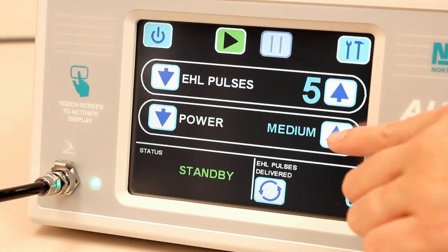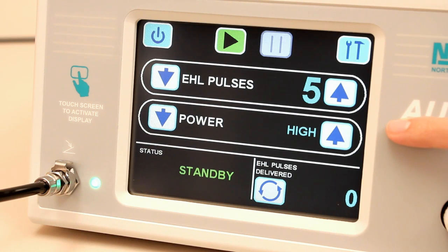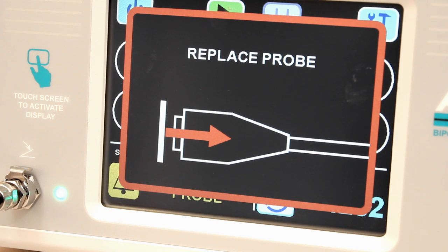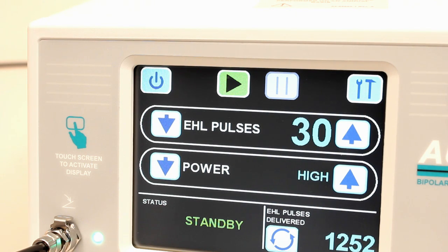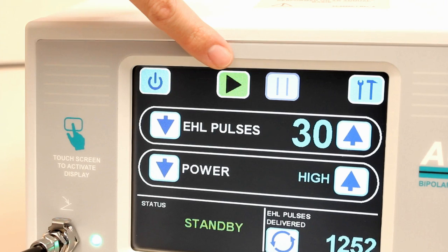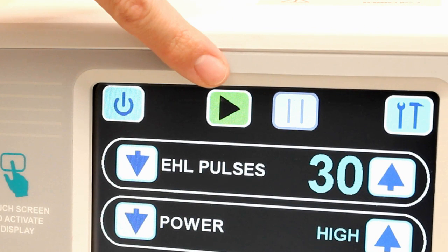Increase the power level for larger, harder stones. When the probe begins to reach the end of its useful life, the Inspect Probe message will begin to appear, and will appear more often as it continues to be used. The Replace Probe message will eventually appear when the probe life ends, and the probe will then need to be replaced. Ensure the Autolith Touch device is in the standby or pause mode when not in active use. The unit is in standby mode when the green arrow symbol is pronounced.